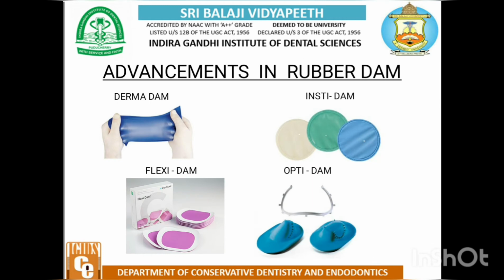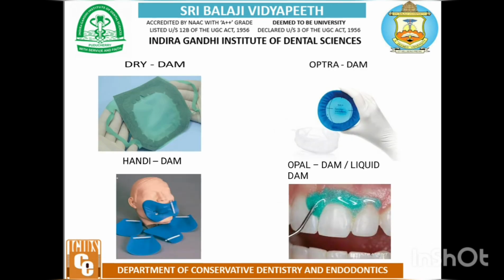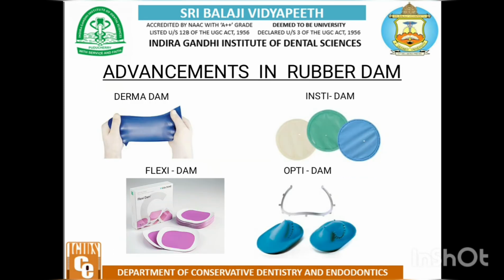Here are the advancements of rubber dam: Derma dam, Insti dam, Opti dam, Flexi dam, Dry dam, Optra dam, Opal dam or liquid dam, Handy dam. Now let's look in detail at each advancement.